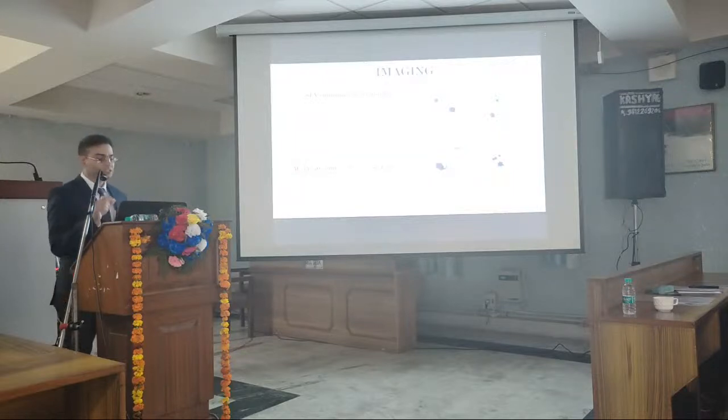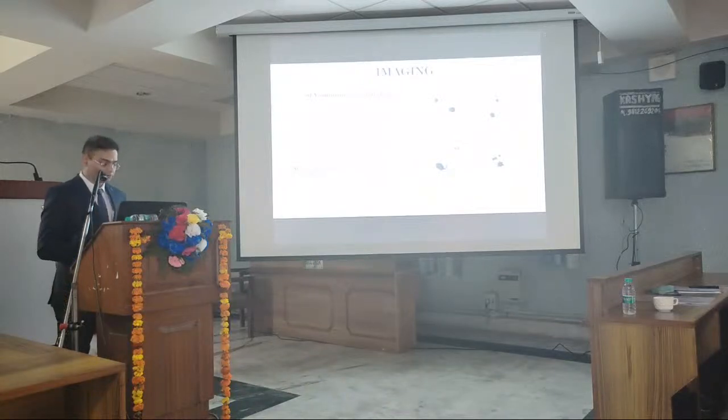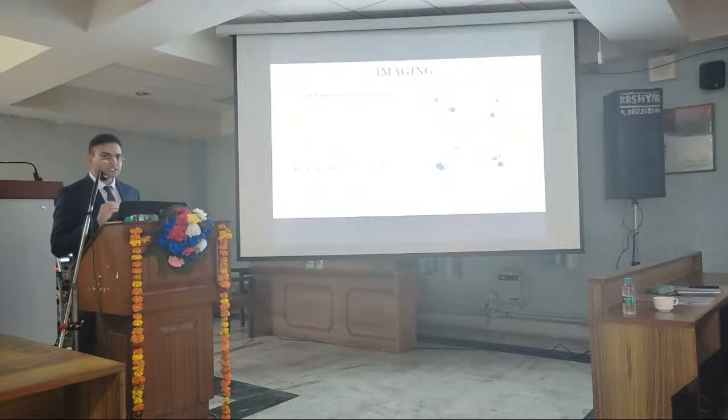In the second image, after giving one injection, we are seeing 2 lymphatic channels draining into 2 separate sentinel lymph nodes. In the third case, we are getting 3 lymphatics, but all draining into 2 collocated lymph nodes. In the last slide, there are multiple channels draining into almost 3 lymph nodes. So we consider all of them to be sentinel lymph nodes.